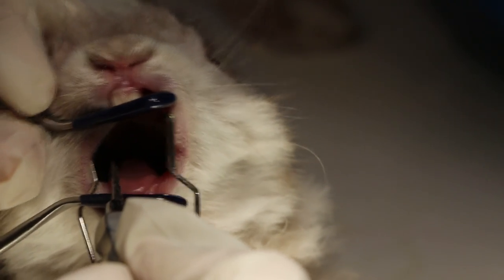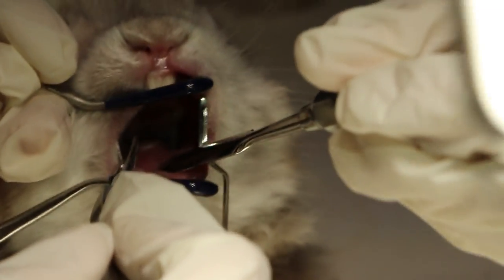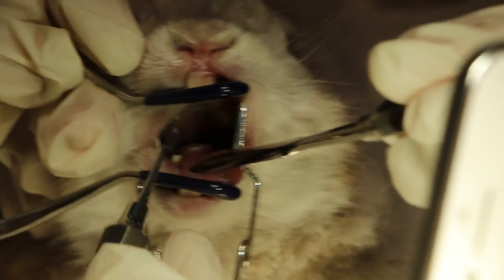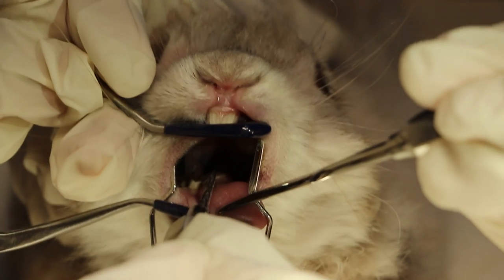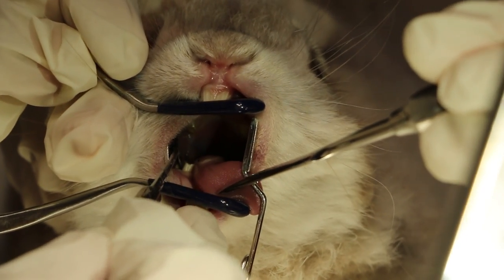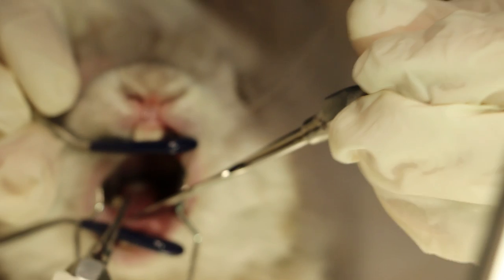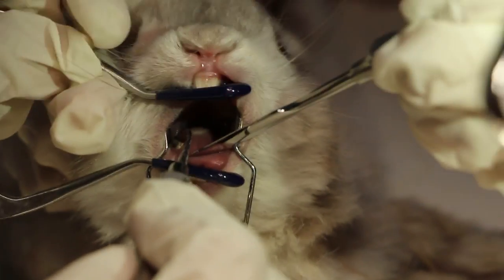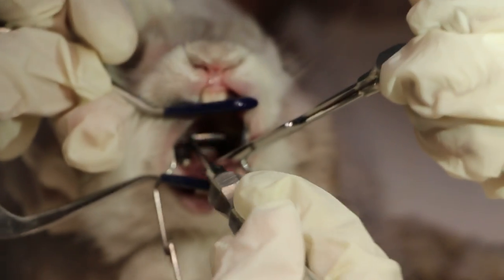Shine the touch light in closer so you can see. You can see some molar — the tooth appears normal and not sharp. To see the molar properly you have to angle the light onto it. The molar luxator works the same as the incisor luxator — just loosening the ligament so that you can pull out the tooth. The ligament attaches the tooth to the gum.